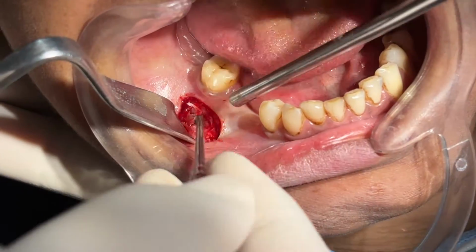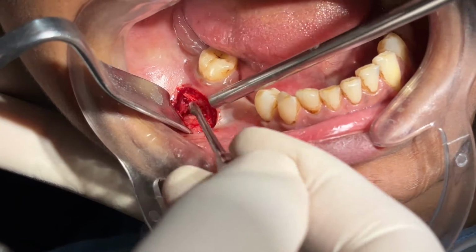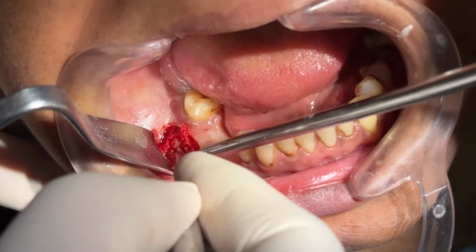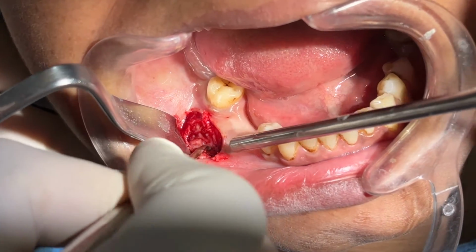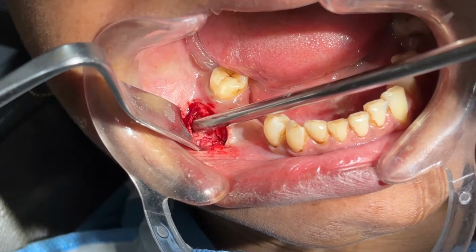The buccal thinning is due to this tumorous growth. So I can easily break these buccal cortical plates and I can see the tumor underneath. So I am removing the bone gradually, like this.